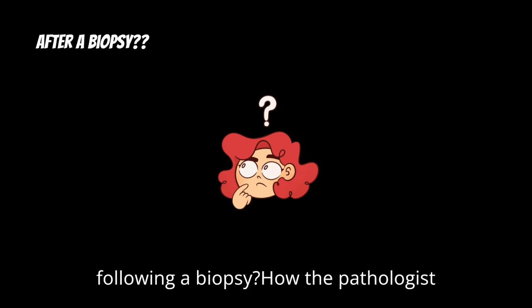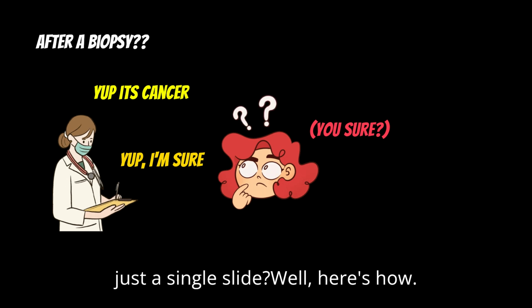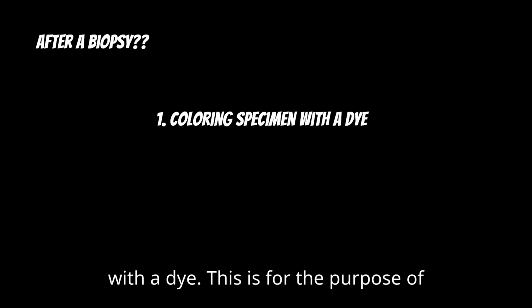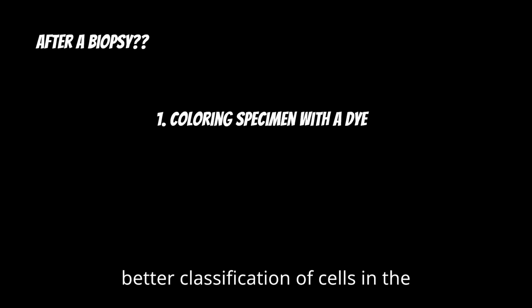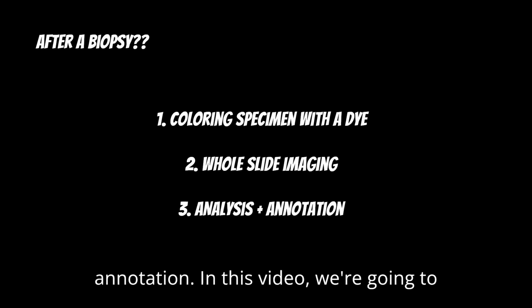Have you ever wondered what happens following a biopsy? How the pathologist detects the presence of diseases from just a single slide? Well, here's how. After a biopsy, the specimen is colored with a dye. This is for the purpose of better classification of cells in the sample, which, in the next process of whole slide imaging, is digitally scanned and archived for further analysis and annotation.